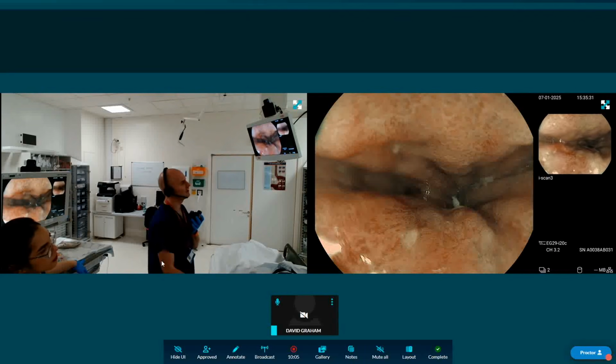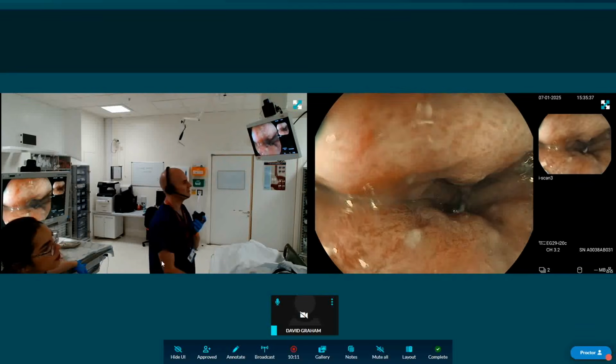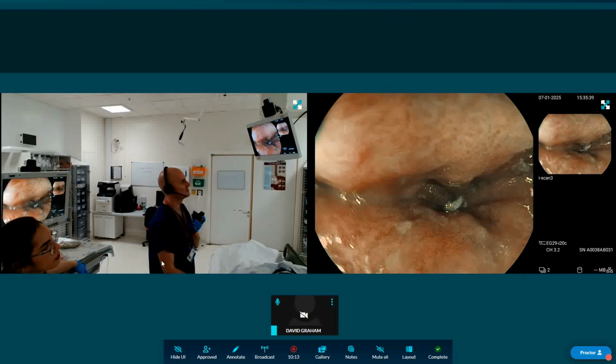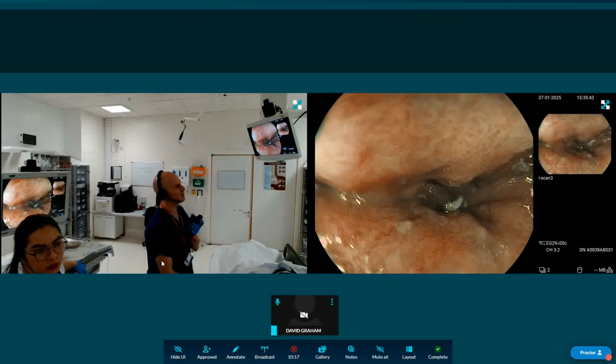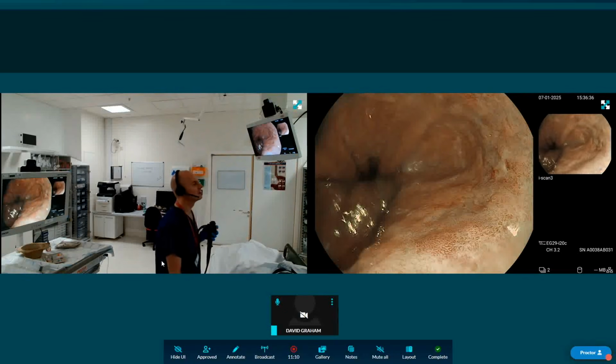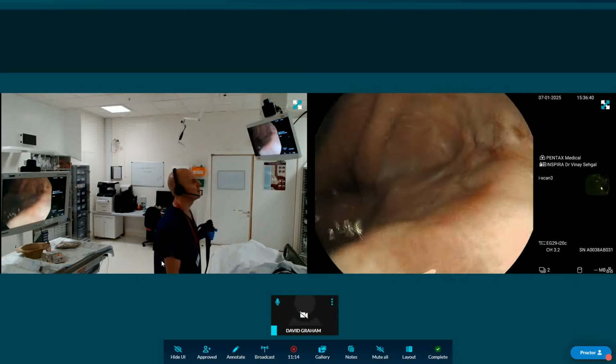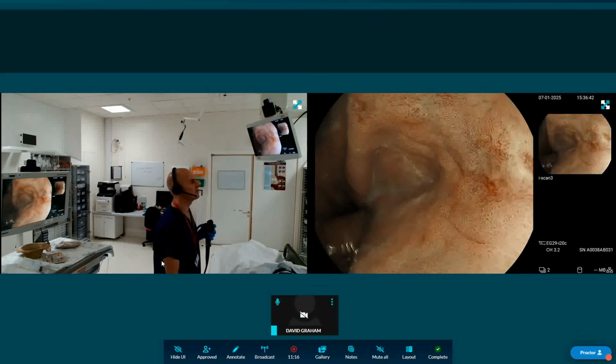You can see the complete loss of vascular mucosal pattern, and you can see the vascular pattern has changed as well. Let me just get a nice, there, you can see it right in the middle of our picture there at the 6 o'clock position. That is undoubtedly dysplasia, and possibly even an early cancer. You see here on the right, at the 3 o'clock position now, you wonder whether that's involved as well actually. Just here, there you go, that's a nice view.